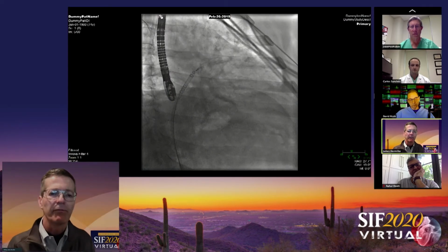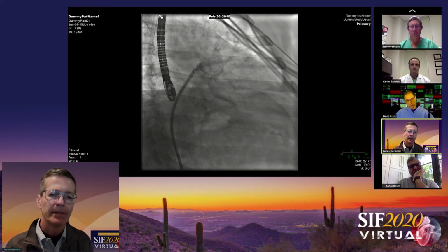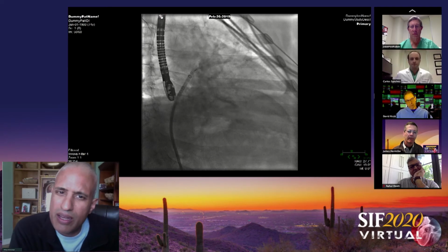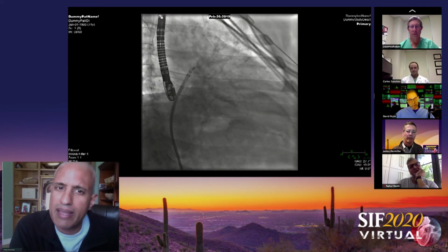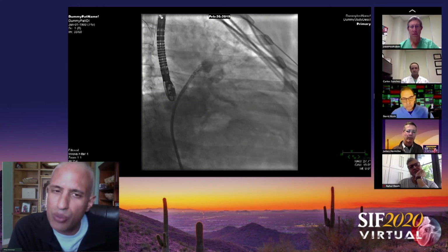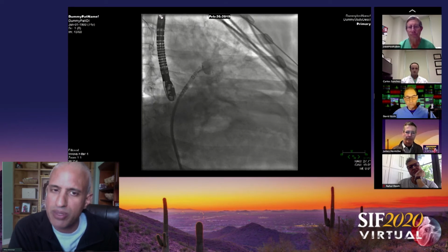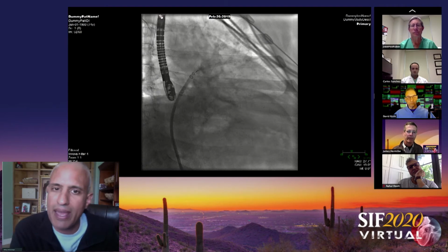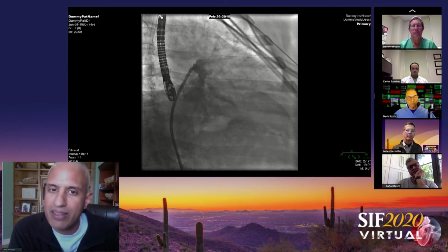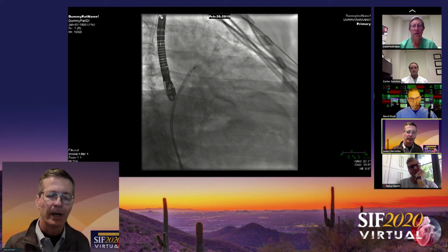Srini, what did you get for your measurements that you chose that 30? I was about 25 in the osteal width, 24 to 25. I actually love using my catheter width once I get in there and plump it up with an angiogram. I measure the catheter width, because it's about 5 millimeters, and it came out to a high 27 or low 30 is where the measurements came about. Anybody do anything differently? I think that's just what I'd choose too.